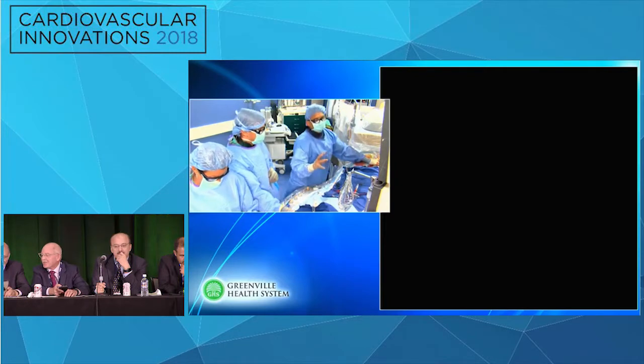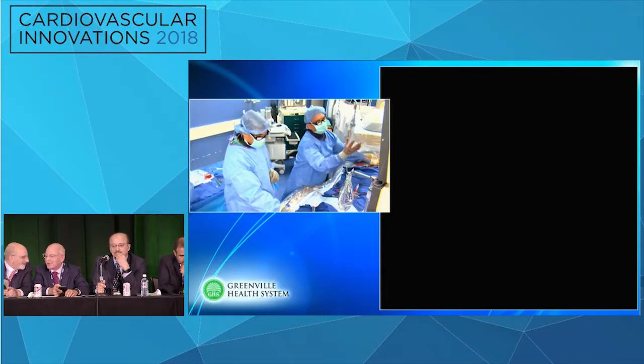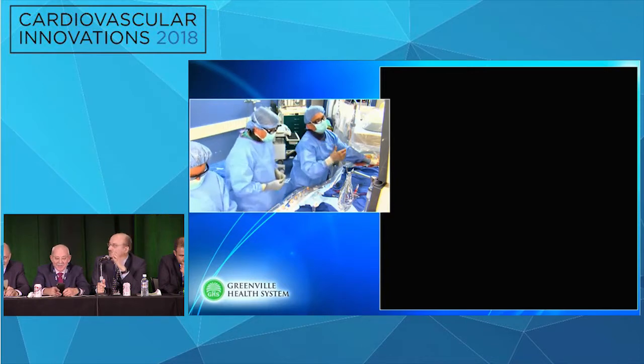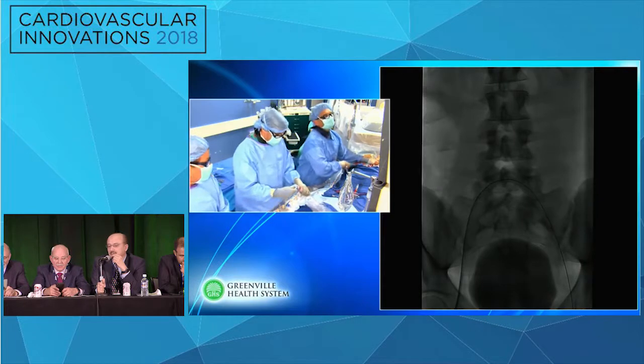I like to take the wall stent into the IVC and then very partially deploy it so it's totally flared out to that diameter, and then bring it back till it protrudes out in the IVC just so where it's covered. I don't like to cover the entire right side, so I'd like not to do that if I can help it.